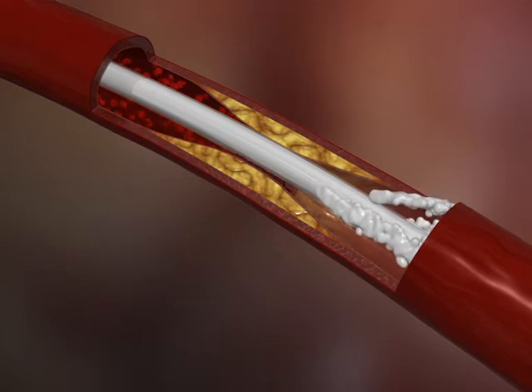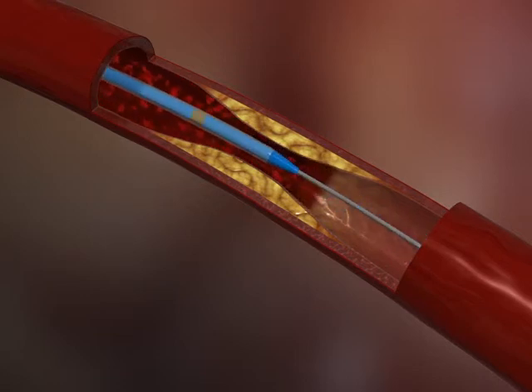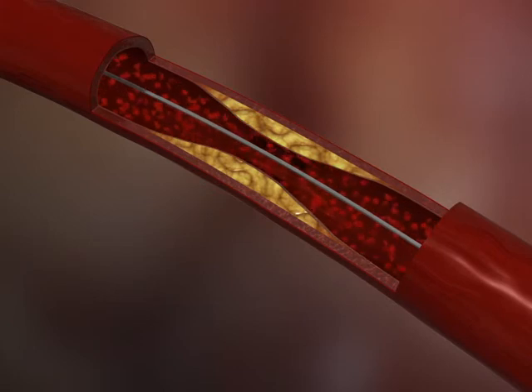As the Amicath continues through the occlusion, anti-aggregants and other drugs can be injected locally through the distal holes, reaching the distal microcirculation and reducing the risk of lesion by reperfusion. When the Amicath is removed, the artery is rechanneled to TIMI 2 to 3 by means of the Dotter effect, enabling the characteristics of the lesion to be viewed and the need for aspiration to be determined.